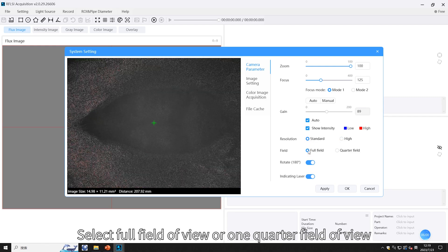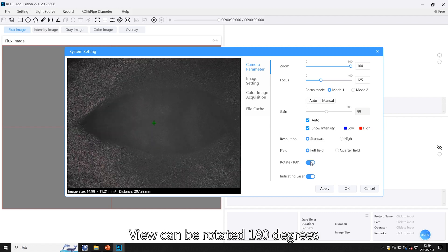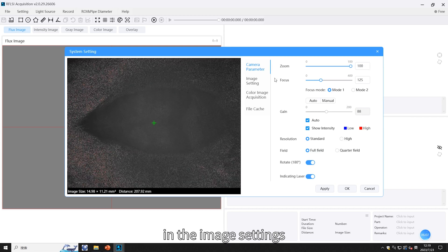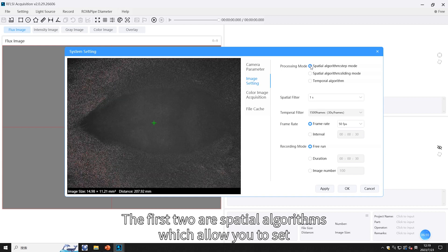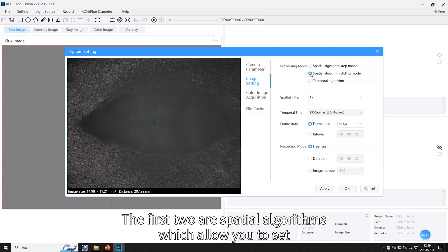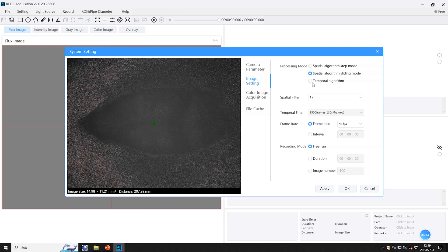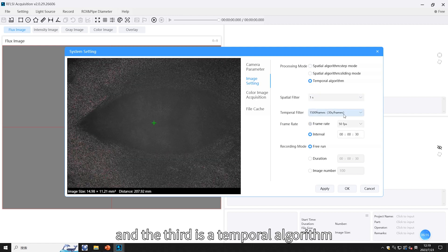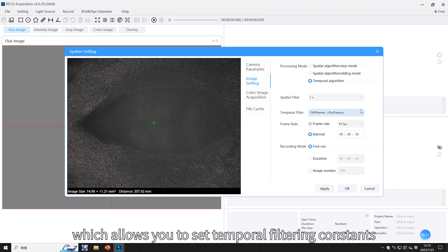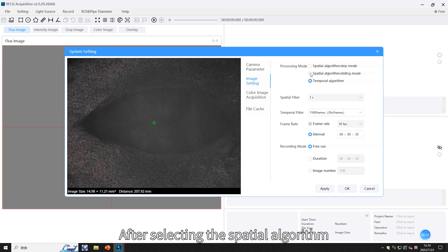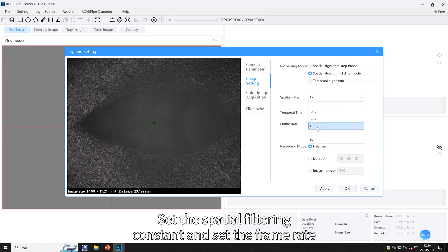Select full field of view or one-quarter field of view. The view can be rotated 180 degrees. In image settings, there are three choices of processing modes: the first two are spatial algorithms which allow you to set spatial filtering constants, and the third is a temporal algorithm which allows you to set temporal filtering constants. After selecting the spatial algorithm, set the spatial filtering constant and the frame rate.